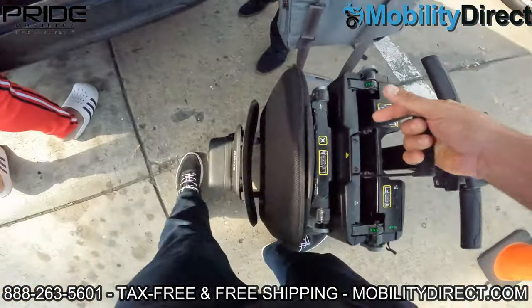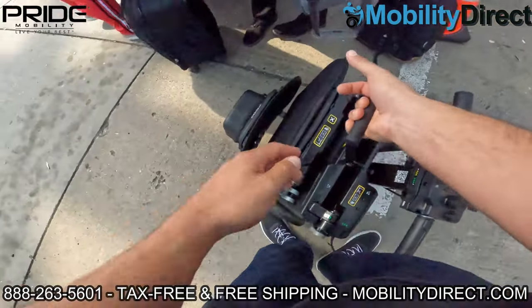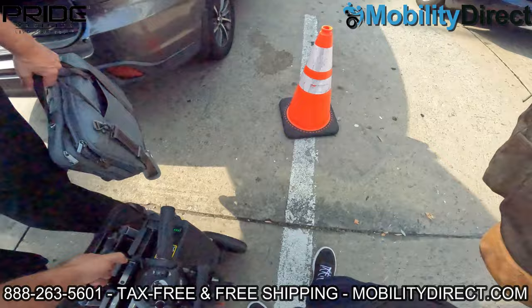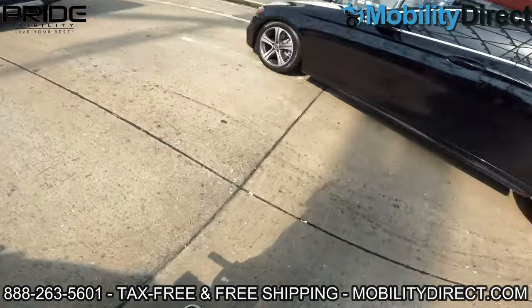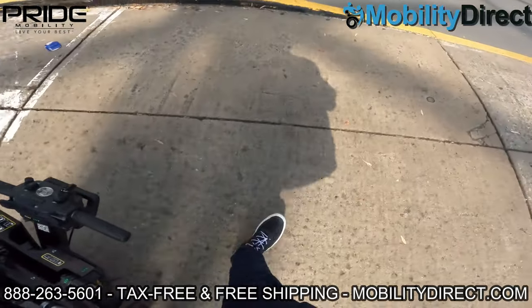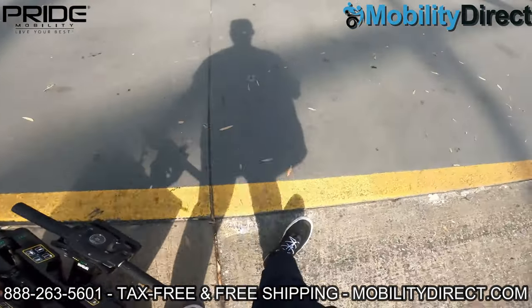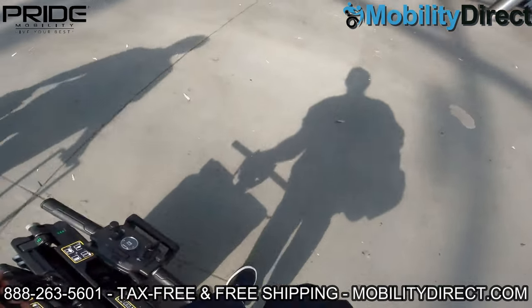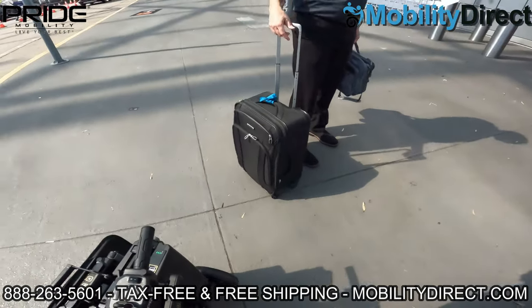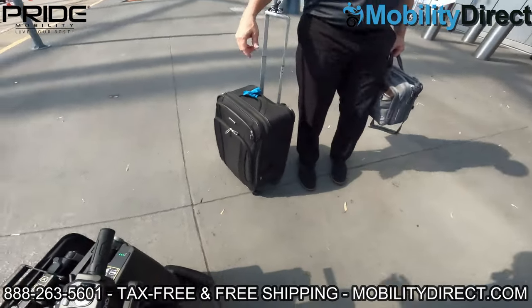What you're seeing here is us just getting out of our shared transportation vehicle — it was stored in the trunk of a car, folded up. We're getting out of the car and away from traffic quickly. We have the unit in trolley mode, which lets you fold it up and carry it around like a suitcase. You just have to fold it up and disengage the automatic brakes in the front.